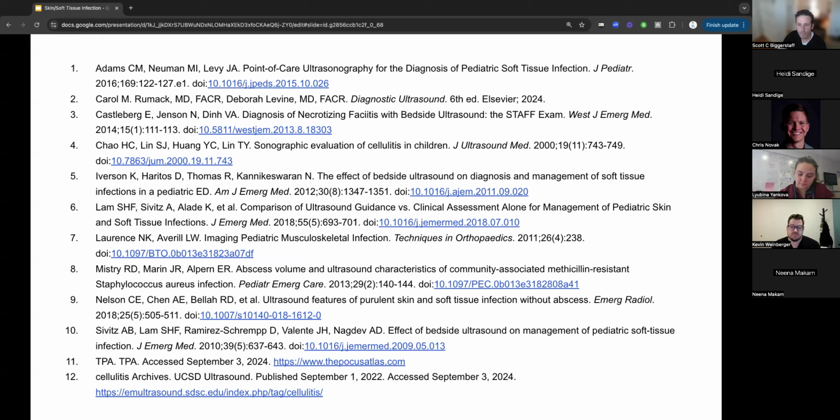Yeah, good word for sure. A lot of times the seromas too don't have a lot of the cobblestoning around them, and they don't have the nastiness inside. They're much more of a uniform fluid collection, almost cystic in nature. So that's another thing that can help you.